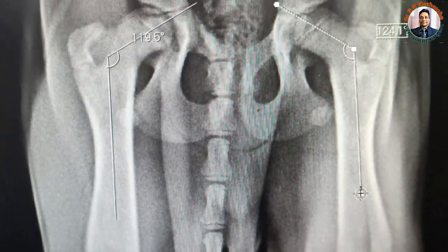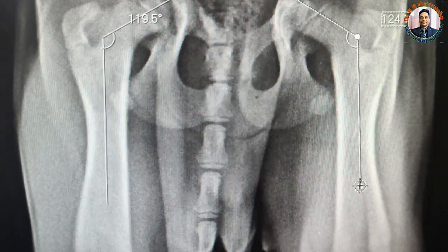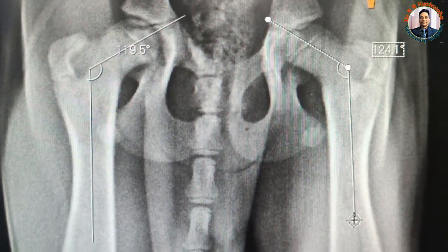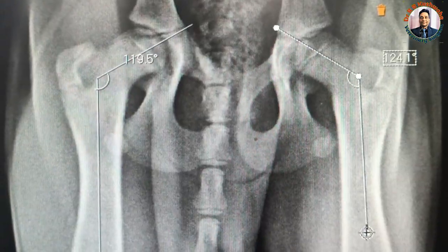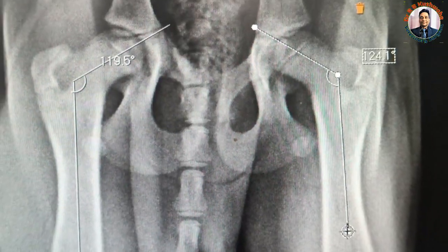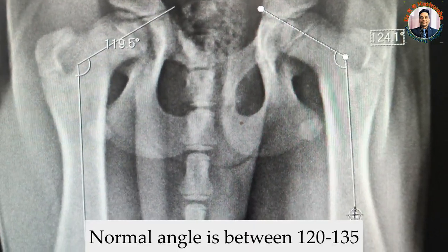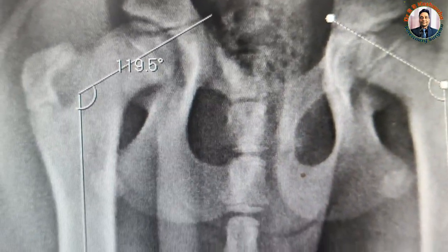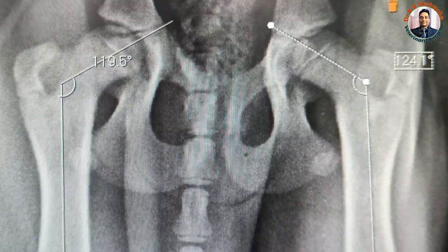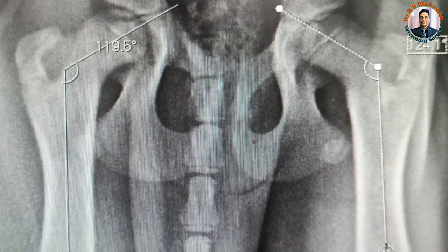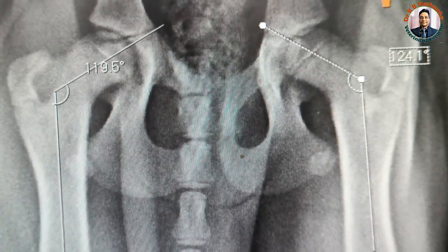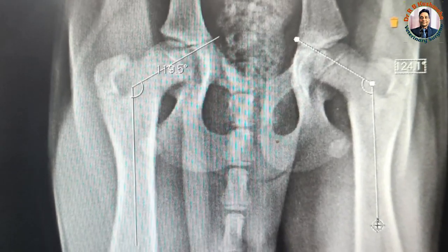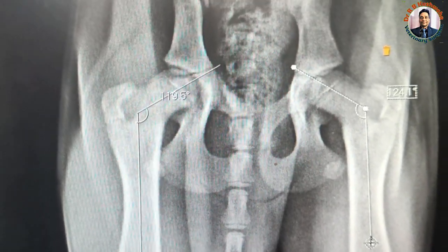The normal femoral head neck shaft angle should not be more than 135 degrees, although the range is between 120 to 135. So this 119.5 is equivalent to 120, and we can consider it at the lower margin of this angle. Although in this case, there is no dysplasia.